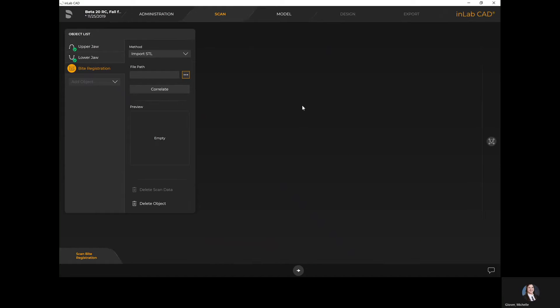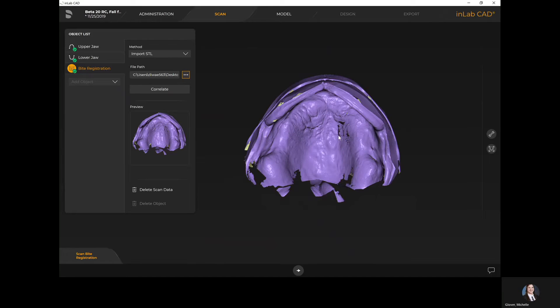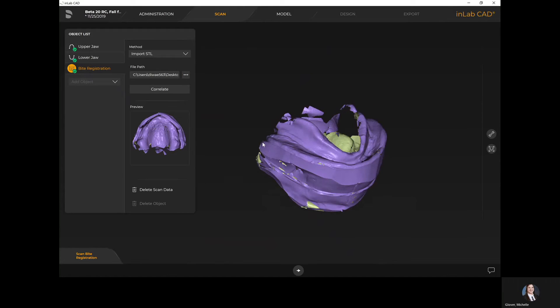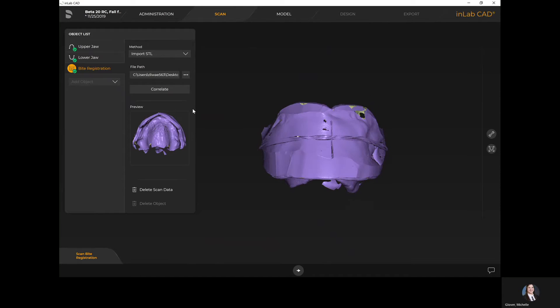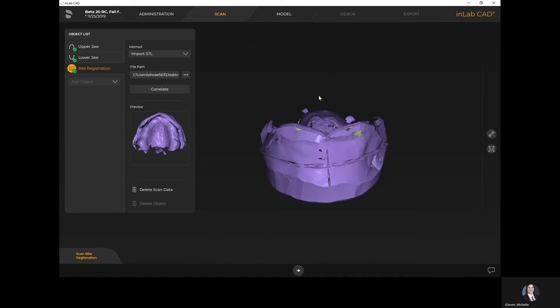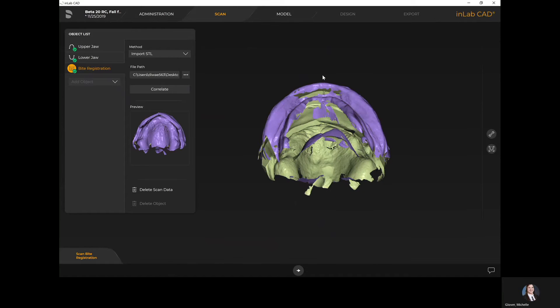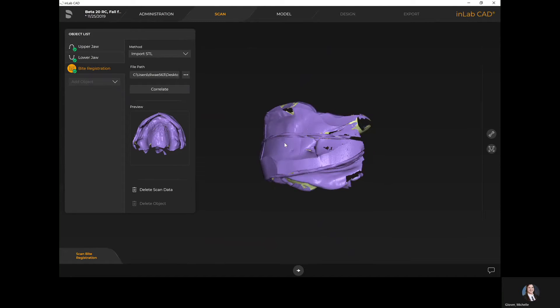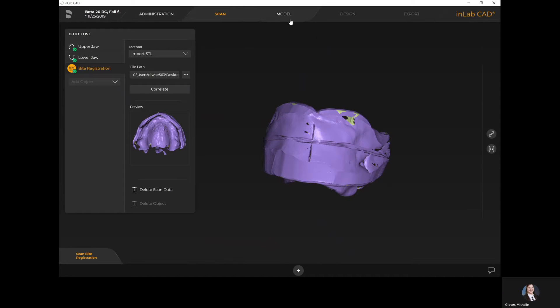I do have the ability to add additional objects if needed. Under bite registration there's a drop-down menu with add object, allowing me to add additional scans. For example, if you have a bite registration and also a reference denture, you could add a copy upper or lower to import additional files. I've now got my bite registration and I selected correlate to have the software correlate the upper and lower scans to the bite rim itself, though normally the STL file already has that taken care of by the scanner.